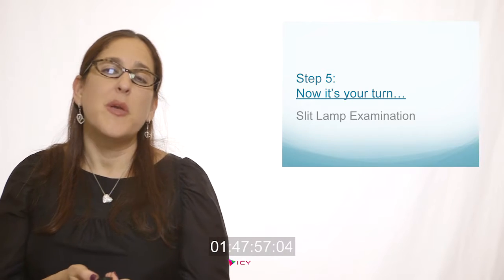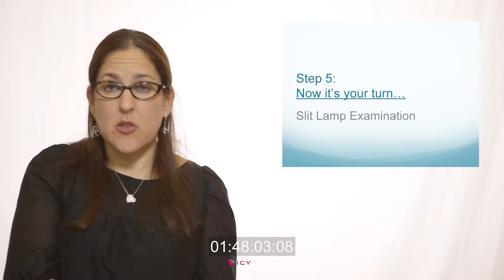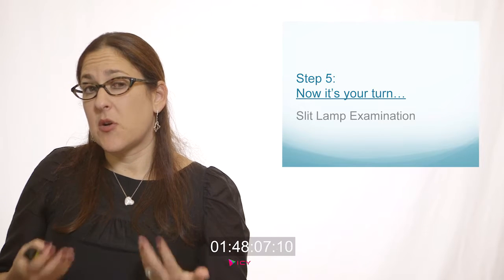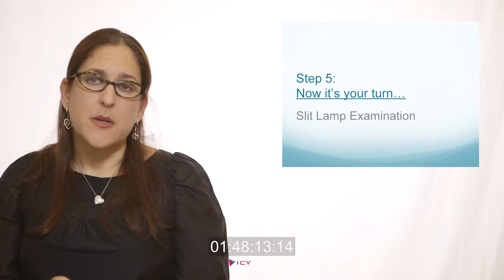So now that we have some idea in our head of what's going on, okay, we know that there's swelling, we know that there's an enlarged blind spot, we know that the ganglion cell layer, or the ganglion cell complex, has not yet been affected. We're going to move forward with the exam and get more information.